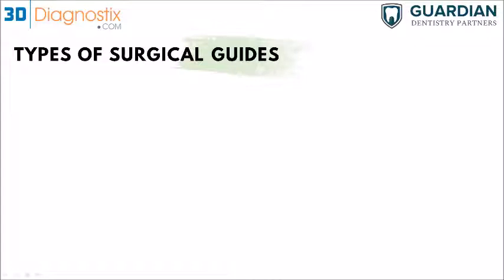Dr. Grimes was asking, does PVS impression material work for the reline? It would, but the problem is that PVS is radiopaque. Sometimes the radiopacity is too much, so we're not going to be able to use that when we do the stitching of the patient's denture to the scan. So I wouldn't recommend PVS impression to reline the denture. Okay. A reline material, I think, is radiolucent. Yeah, a soft reline material.